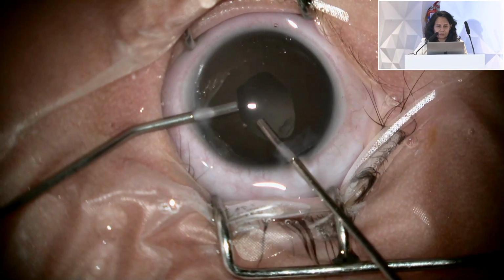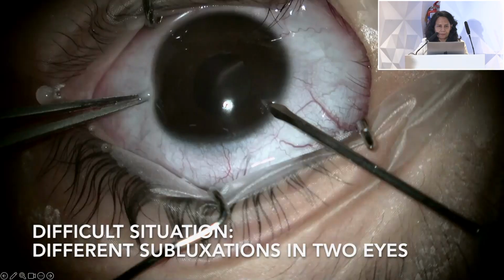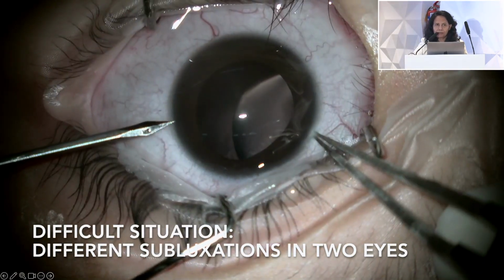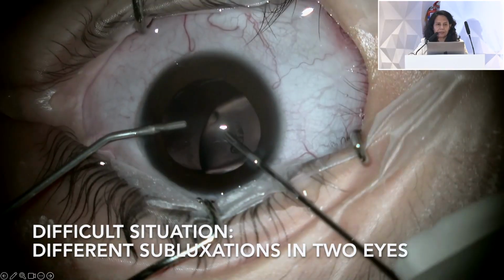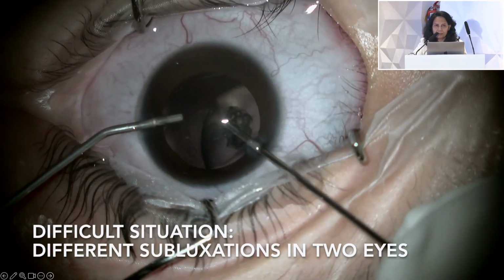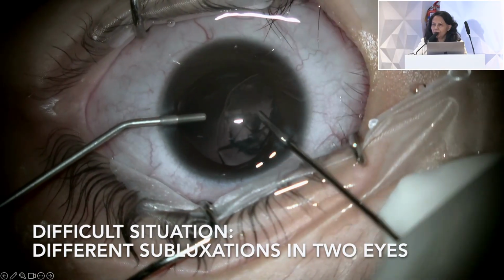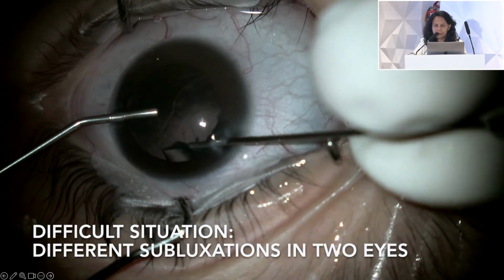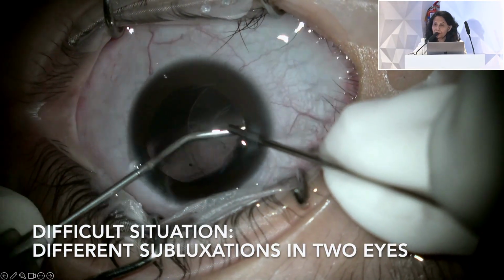This is the first video. And now the second one. Sometimes there are difficult situations, different subluxations in the two eyes. One eye had an anterior subluxation and the other eye had a posterior subluxation. So in anterior subluxation, you will not have a very good capsule, and iris fixating lens is also difficult because all the iris has atrophied. And this is the posterior subluxation lens.